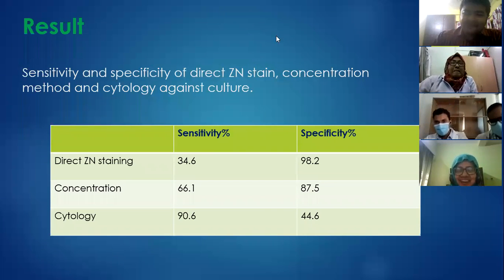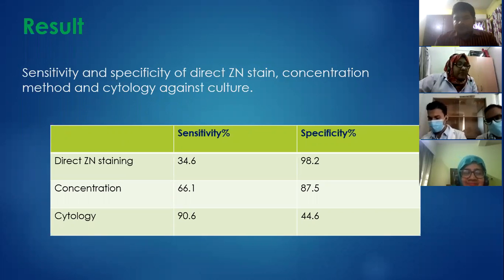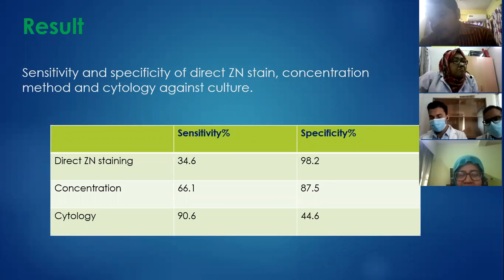Anyway, Sajjad, do you want to add? With your permission, I want to add something, madam. Earlier there was a question whether the aspirated material is suitable for culture or not. Madam, after processing and concentrating this aspirated material, the bacilli may be not viable or dead. So this material after concentration is not suitable for culture. Though the culture is very sensitive and specific and the gold standard, this concentration method is very cheap, and we can get the result very rapidly. And culture, we can get result after 2 to 3 weeks.